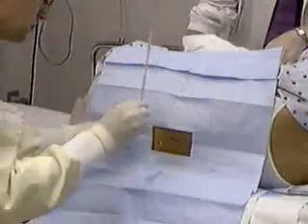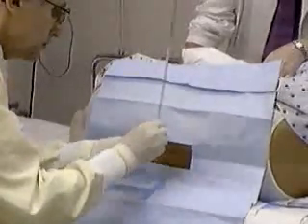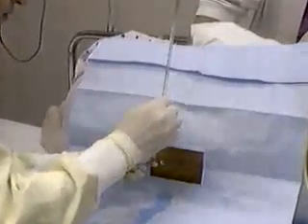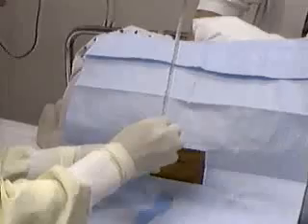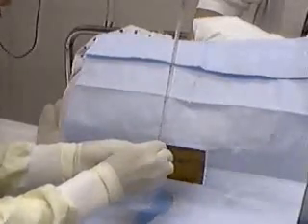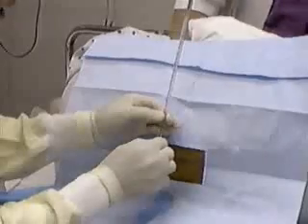Attach the stopcock to the manometer and then to the hub of the needle. The lever of the stopcock points to the side that is closed. Turn the lever toward you — the CSF will now flow into the manometer. Note the level to which the CSF rises. If the opening pressure is high, ask your assistant to straighten your patient's legs a little to see if the pressure drops to normal. An increase in abdominal pressure will falsely elevate the opening pressure.